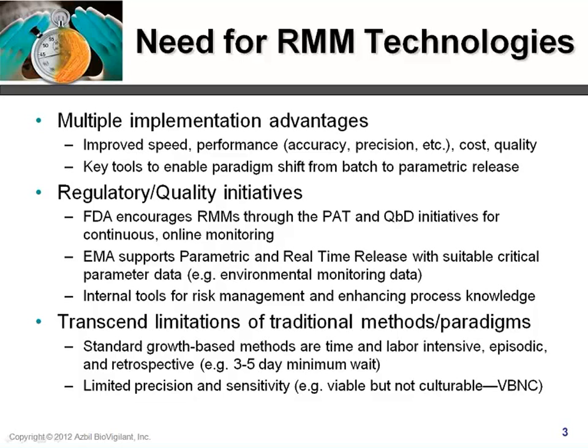Now, I already mentioned that enhanced performance of RMMs may be possible over traditional methods, and they may even have sensitivity down to a single microbe. Now, note that I didn't say a single CFU.